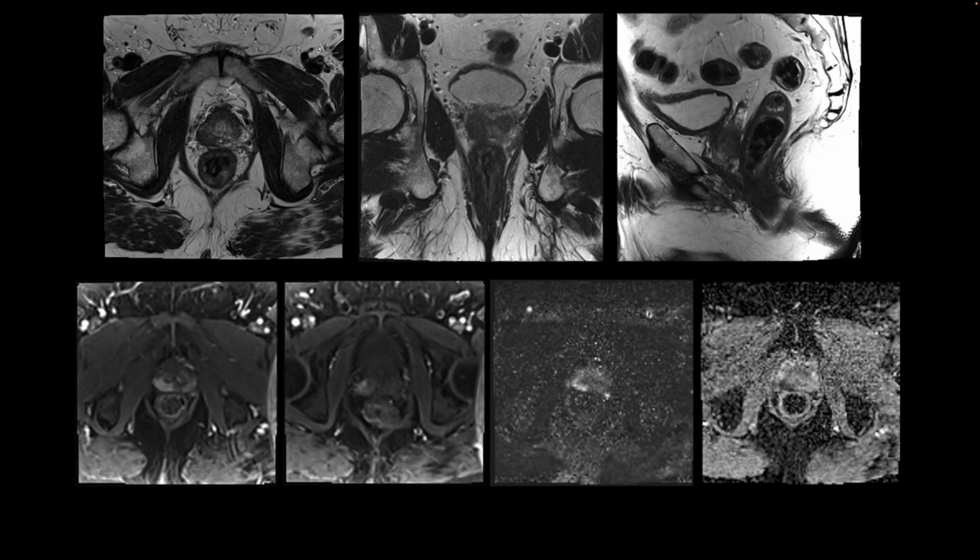Here's our next patient. They were evaluated for prostate cancer. We performed an MRI of the prostate, and the images on the top are small field of view T2 weighted images in all planes, the axial, the coronal, and the sagittal. We find that this low T2 signal focus in the right peripheral zone is the primary prostate cancer.